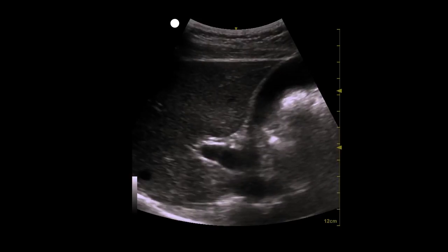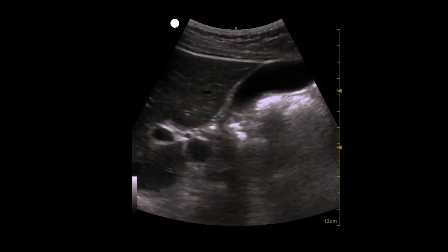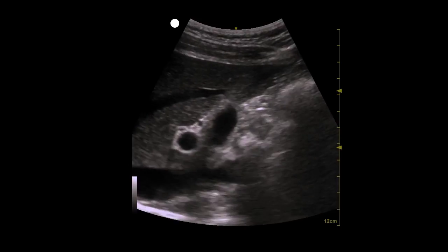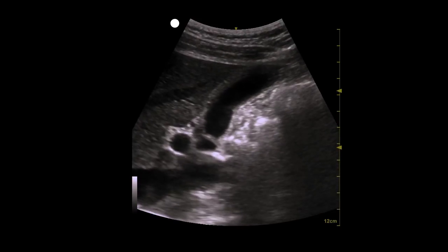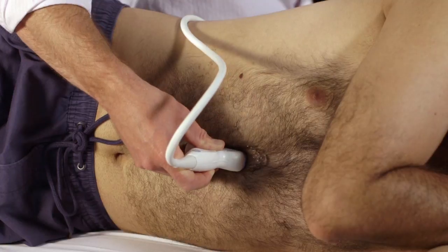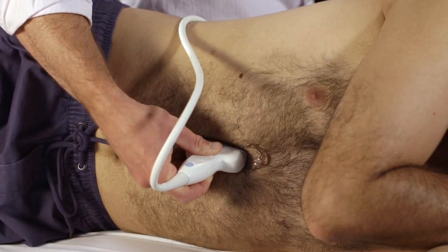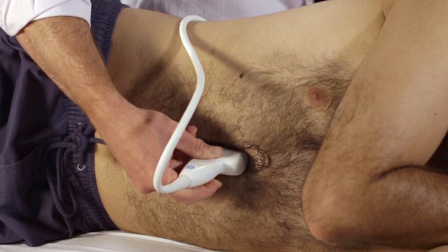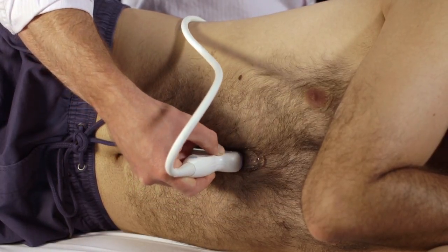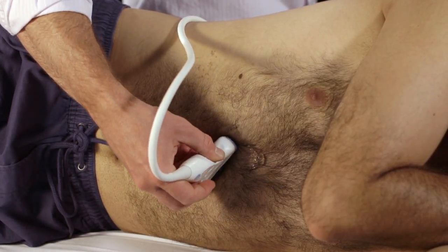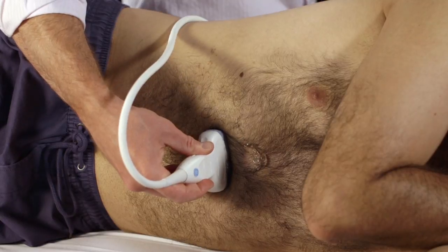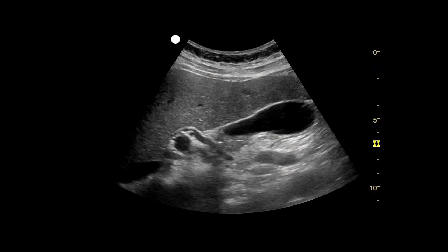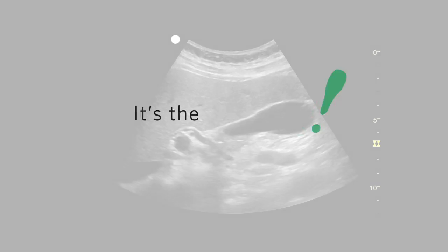Remember that the gallbladder may have any orientation — it will not necessarily lie in longitudinal. Thus, you may need to tilt and rotate the probe clockwise or counterclockwise with fine movements until the gallbladder is seen in its true long axis. You can confirm that it is the gallbladder by finding the exclamation point sign.